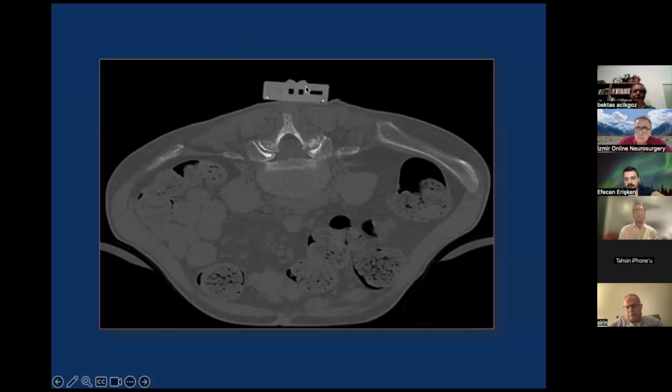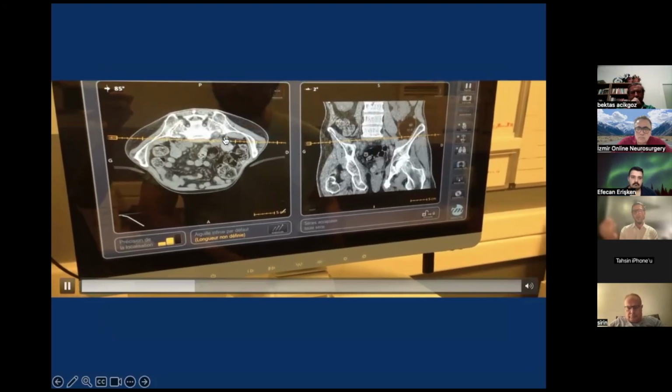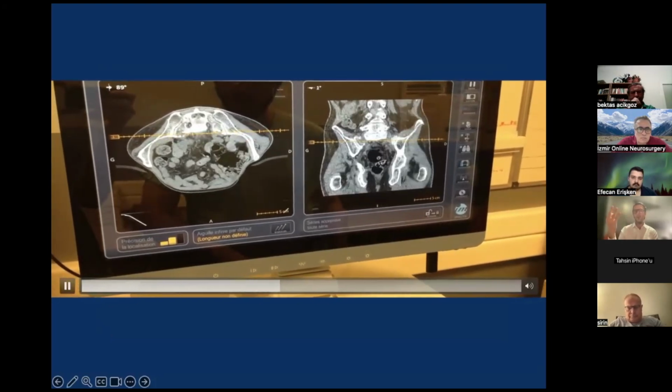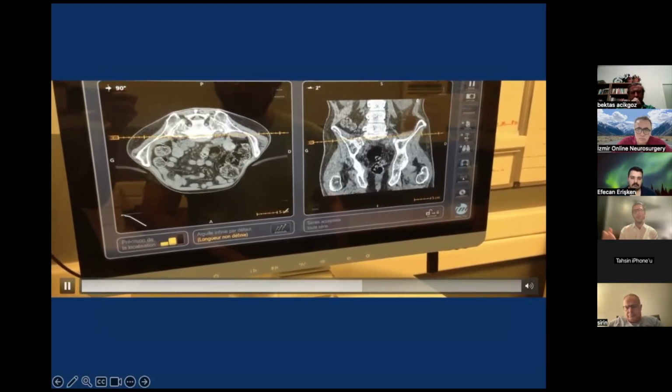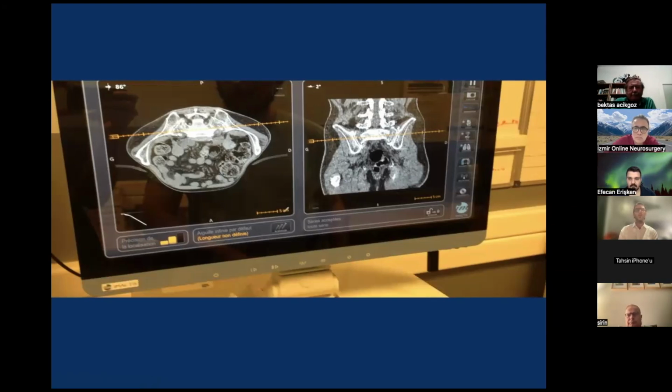So this is the positioning of the emitter on the patient, and here you can see in live, we connect the device to the proximal aspect of the needle, and you can incline the trajectory of your needle to see what is the best trajectory to avoid here the foramina, the sacral foramina, in which you have the S1 roots.